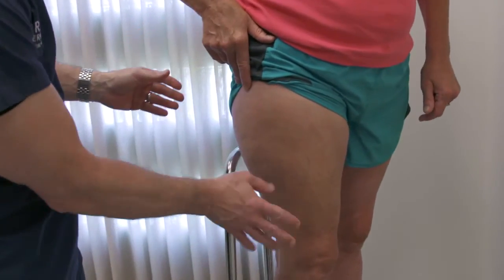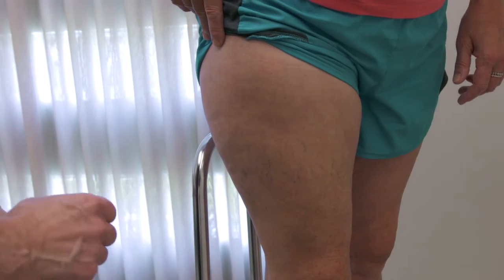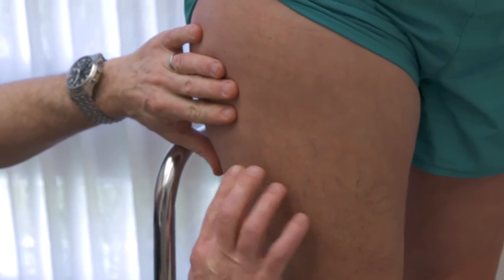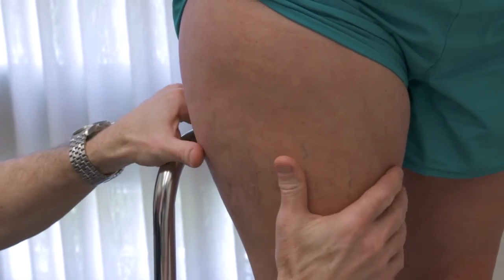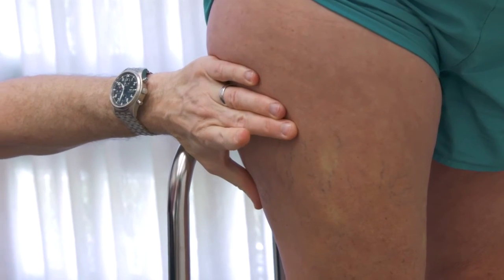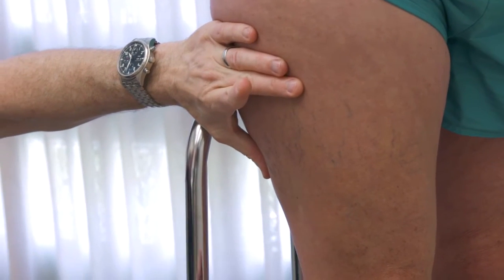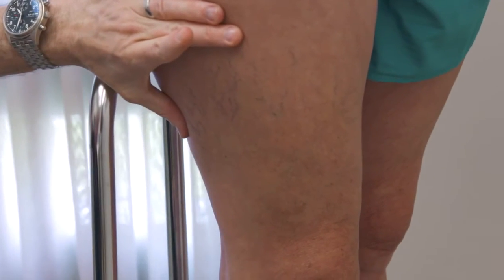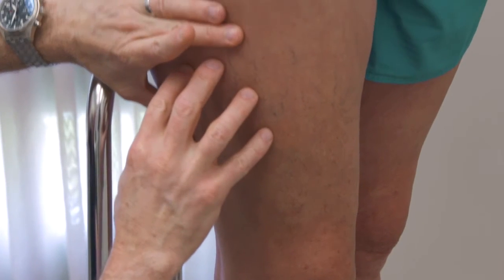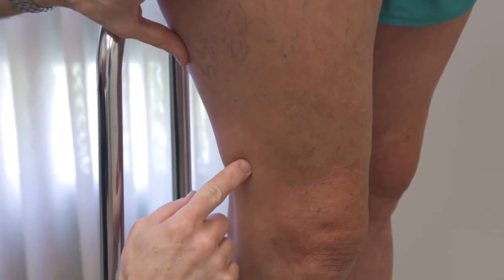So what we're gonna do today is get rid of these spider veins for you that you don't particularly like the way that they look. When I look at your legs here, Deb, you have these spider veins which is really what catches your eye and what you want to get rid of. In addition to that, you have this deeper blue vein, which is what we call a reticular vein, and it feeds those spider veins.